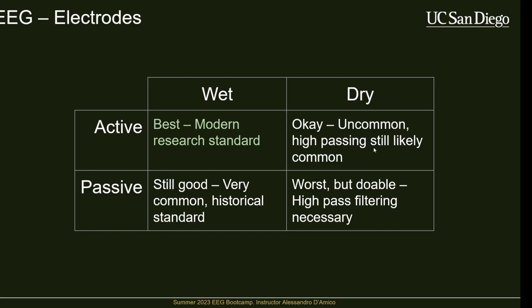Active dry electrodes are not that common, but they're starting to emerge. There's a really good Nature paper that sort of tries to see if dry electrodes are good enough for clinical and research use, and the electrodes they use are dry active electrodes.